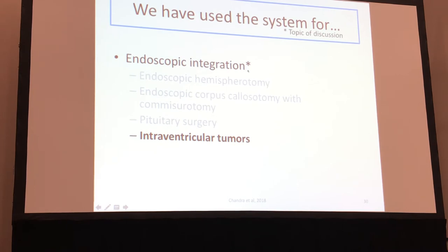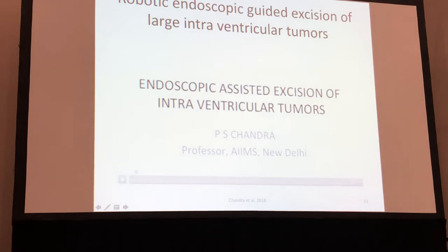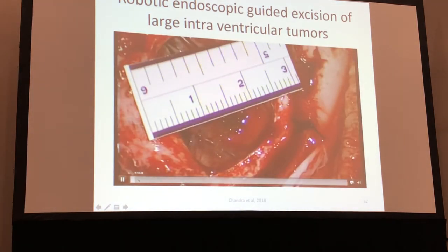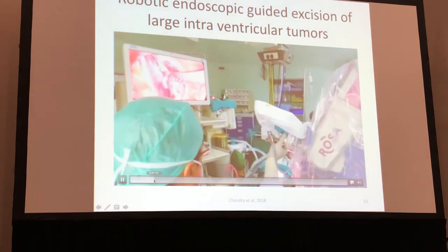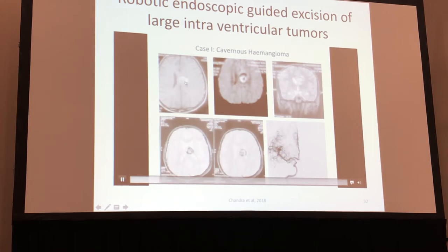So then for intraventricular tumors. With an experience of hemispherotomies, we thought we could use either an interhemispheric approach or a transcortical approach for large intraventricular tumors. So I can show you a few videos on this. So this is a case of a large cavernoma, which was there just over the corpus callosum.